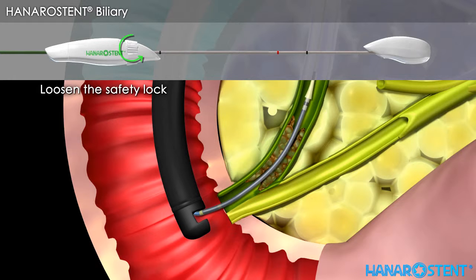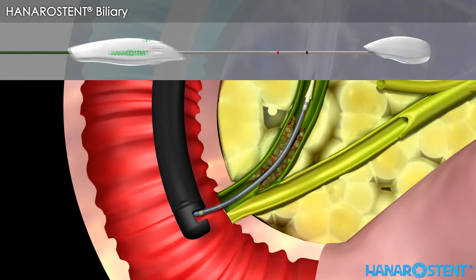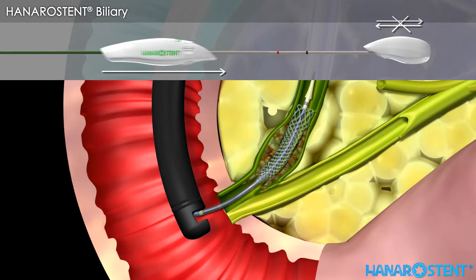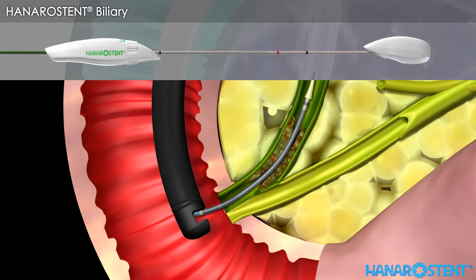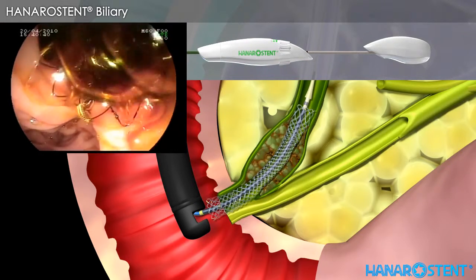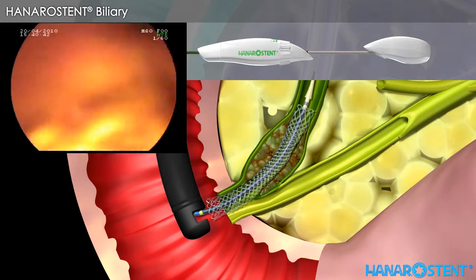Loosen the safety lock by turning it counter-clockwise after checking the location of the stent. Hold the inner shaft handle firmly with one hand and then gently pull the outer sheath handle. Before pulling the outer sheath handle beyond the red marker, the stent is always resheathable by pulling the outer sheath back until it passes the distal black marker. Check the endoscopic view of full deployment and drainage of bile fluid.